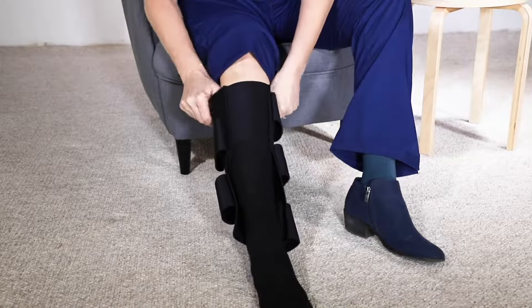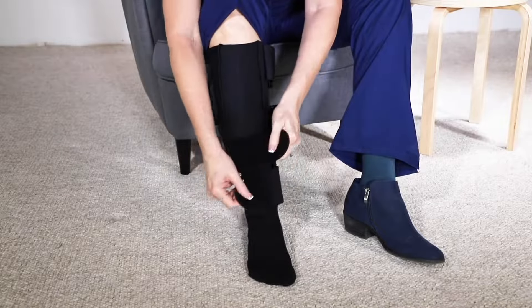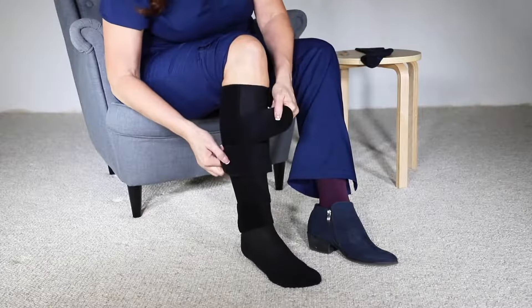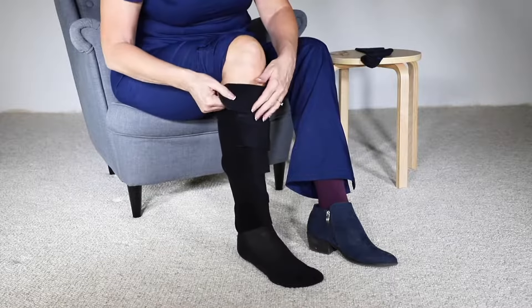Pull the garment up the calf until it is roughly five centimeters, or two fingers width, from your knee crease. Close the straps without applying any tension, making sure that they are flat without gaps.